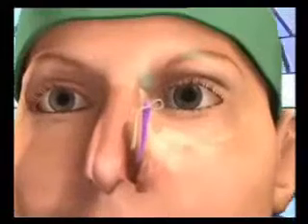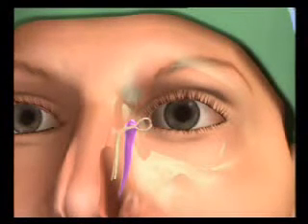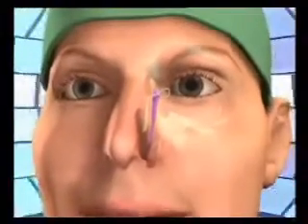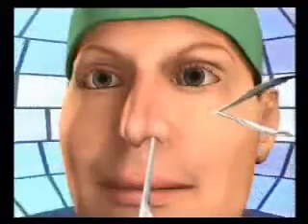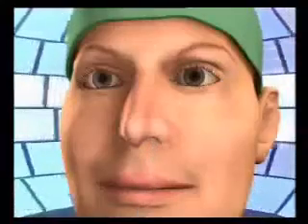Transcanalicular and endonasal laser-assisted dacryocysto-rhinostomy offers a series of advantages. It does not leave a skin scar. Disinsertion of the medial canthal tendon or incision in the orbicular muscle is not required, and there is no injury to the angular vessels or bone fracture. Furthermore, bleeding and intraoperative and postoperative pain is minimal. Surgery time is shorter. General anesthesia and hospitalization are not needed. Postoperative morbidity is low, and resumption of daily activities is rapid.